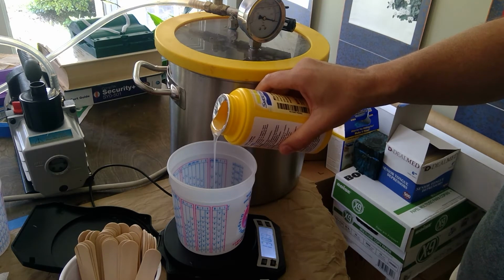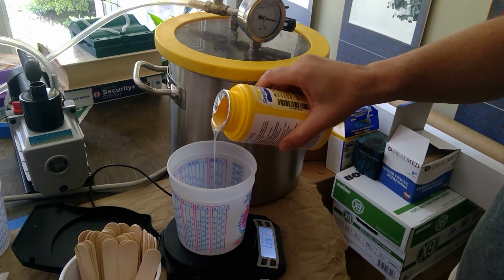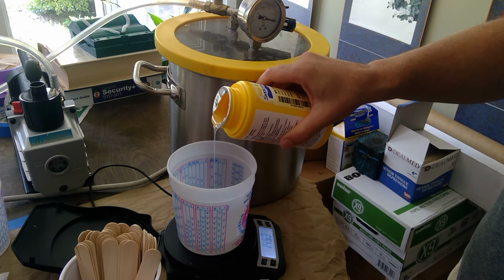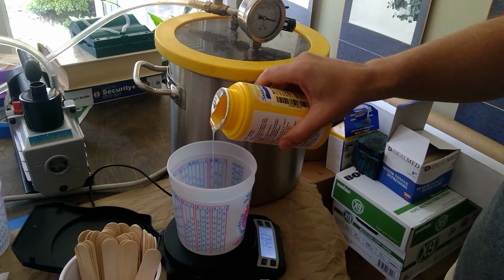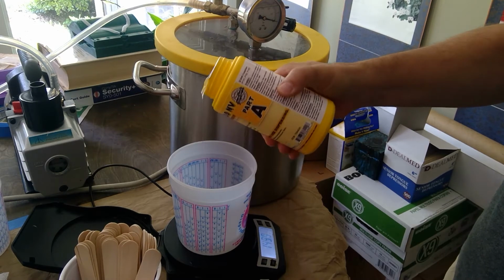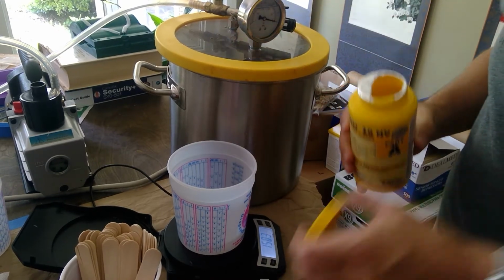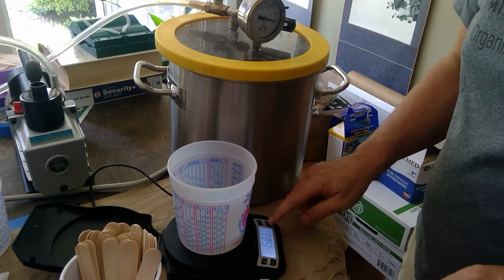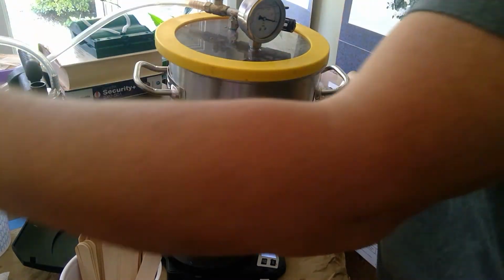Keep filling up, and like I said, we're trying to get to 150 on here. It doesn't have to be perfectly precise, but get as close as you can. So once you get into the 140 range, just start slowing down your pour a little bit more as you approach. And 150 there. So that's 150.53.